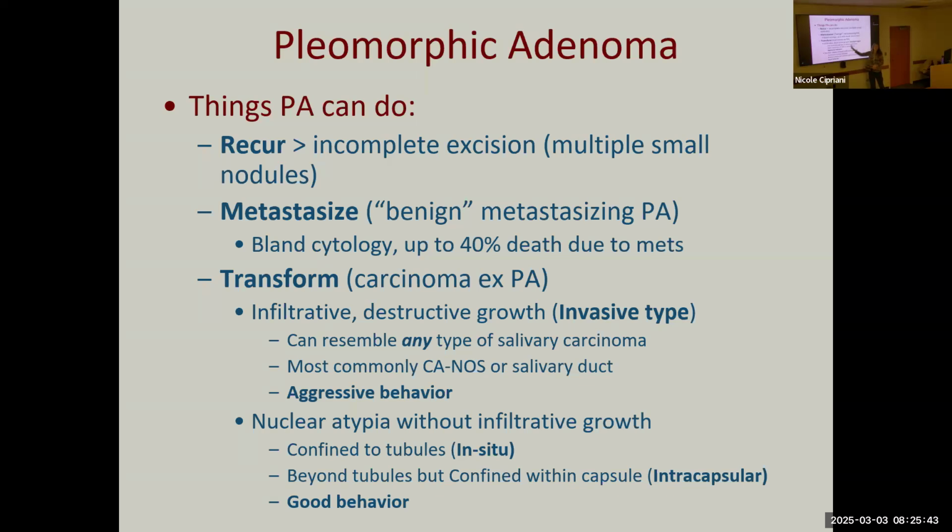It can certainly transform to a high-grade carcinoma ex pleomorphic adenoma. Generally, it can resemble any salivary type of carcinoma, it's thought. The common ones are salivary duct, which we'll see, or a generic bad carcinoma NOS, but usually this is high grade.